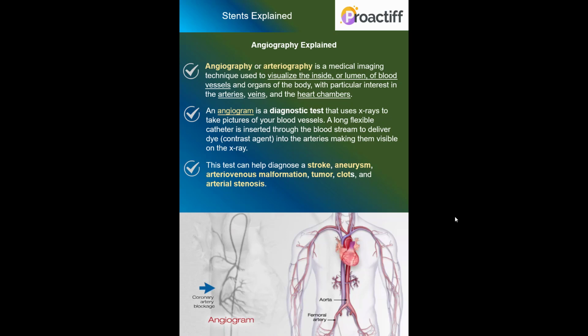So the color is reflected because of the medical imaging techniques. Certain dyes are induced. As you have seen in the black and white contrast picture, the complete veins are coming through, just like in an X-ray you see the bones. Now you can see the arteries and the veins by inducing the contrast dyes. And these are done by super specialists, and they have to be engaged to do such advanced procedures. And it's a life saving exercise.